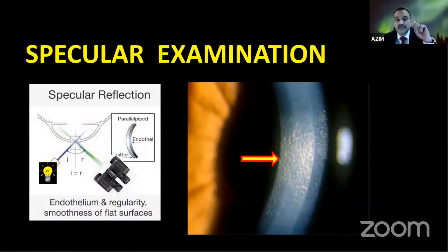This is very useful if you're doing a cataract preoperative evaluation, because if the endothelium is not healthy, later when you do a cataract surgery, the surgery could go wrong.